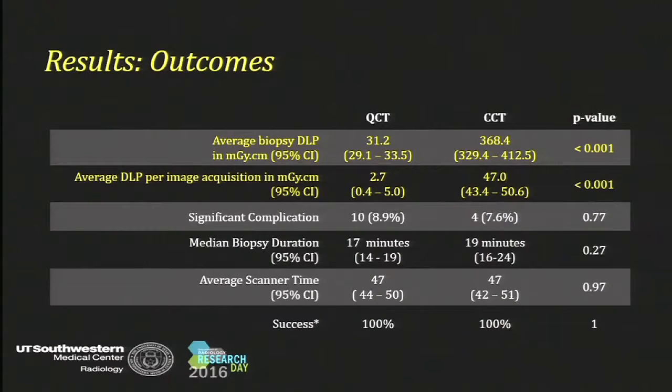biopsy duration, 17 minutes, and scan utilization time was essentially 47 minutes for both of them. So that's from the start to the finish. The biopsy duration is from the time that the lidocaine needle went inside the patient until the last needle was inside the patient. The scan utilization is from the time the scout image was taken to the last time you had to image the patient. It actually should be more, but the data is what the data is.